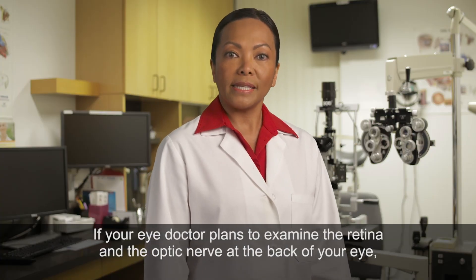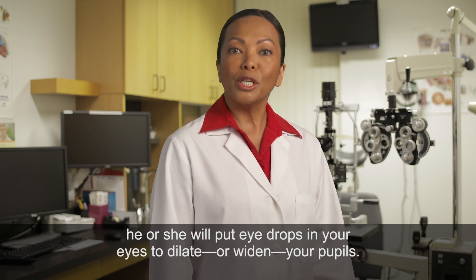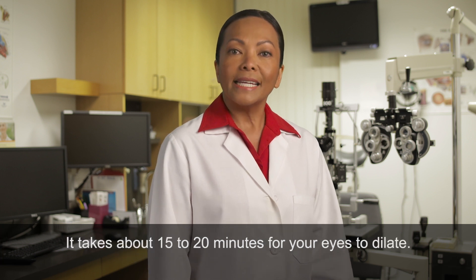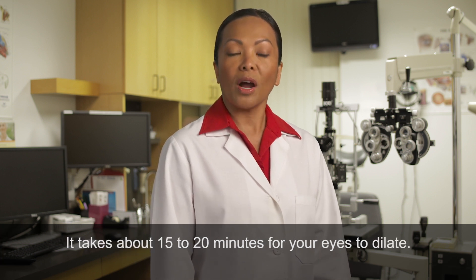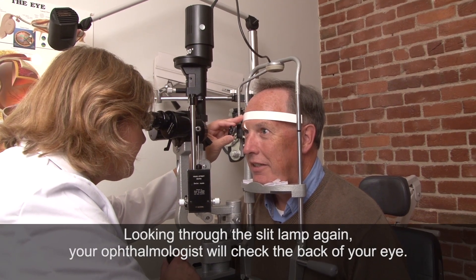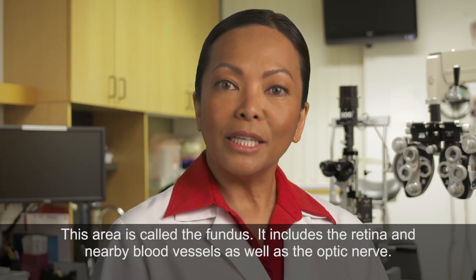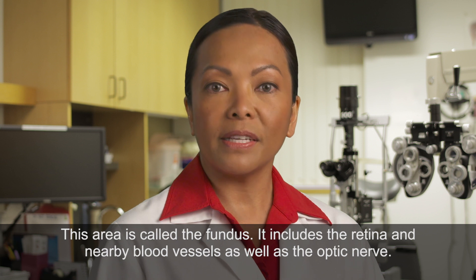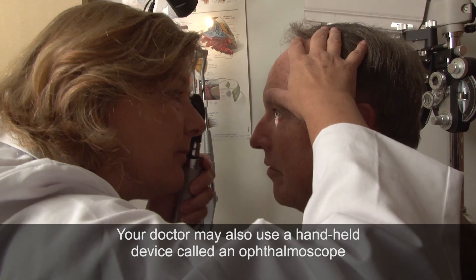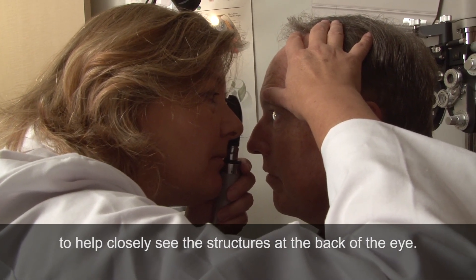If your eye doctor plans to examine the retina and the optic nerve at the back of your eye, he or she will put eye drops in your eyes to dilate or widen your pupils. It takes about 15 to 20 minutes for your eyes to dilate. Looking through the slit lamp again, your ophthalmologist will check the back of your eye, called the fundus. It includes the retina and nearby blood vessels as well as the optic nerve. Your doctor may also use a handheld device called an ophthalmoscope to help closely see the structures at the back of the eye.